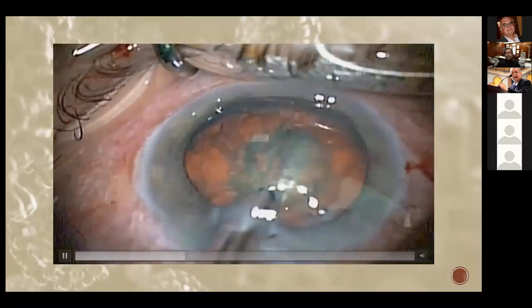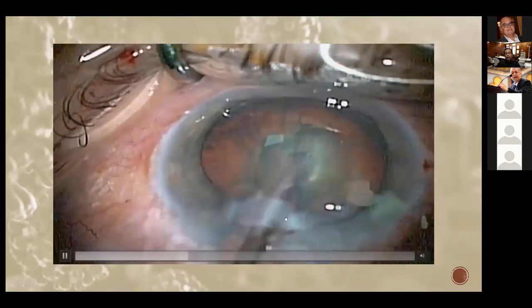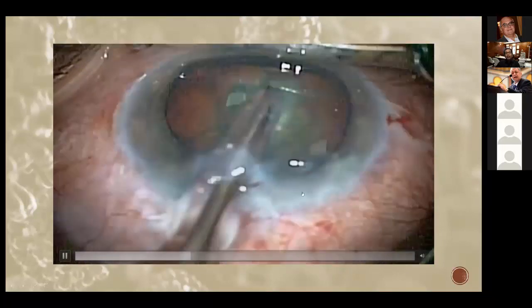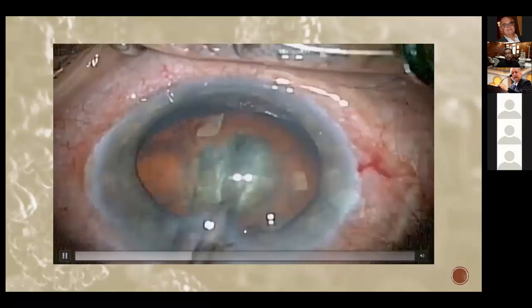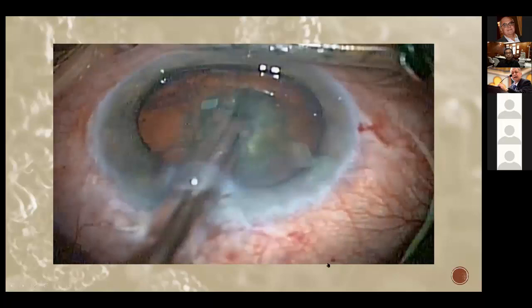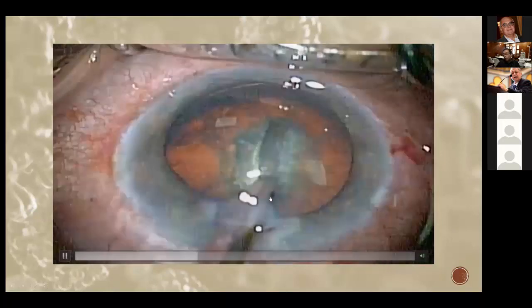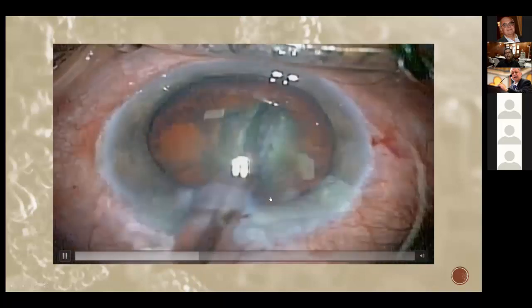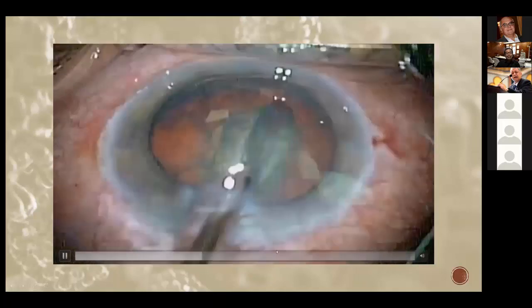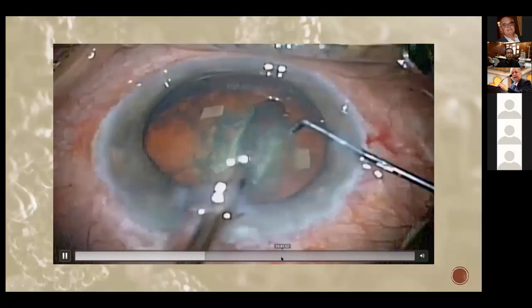Now I decided I'm going to do divide and conquer with minimal rotation. So I'm not going to rotate the nucleus as much as I can. I'm doing a very high phaco here because I don't want to be pushing and moving the nucleus. It's preferred that I would do vertical chopping in cases of zonular dialysis, but you need to have the proper instrumentation for that. I didn't have instruments that are good for vertical chopping.